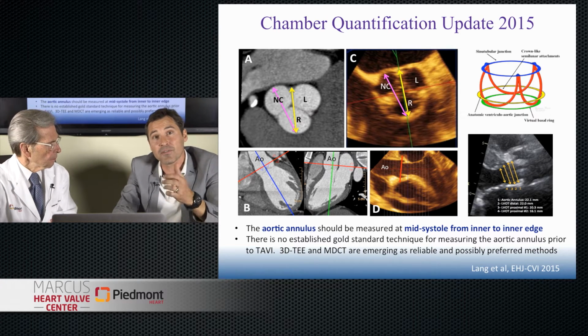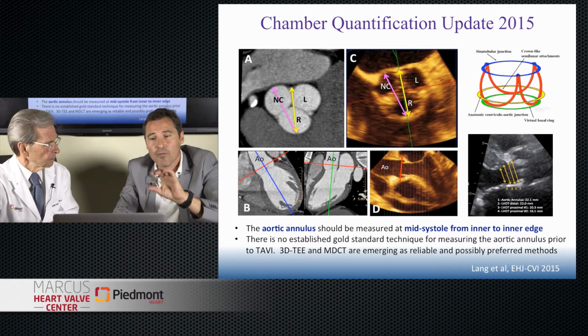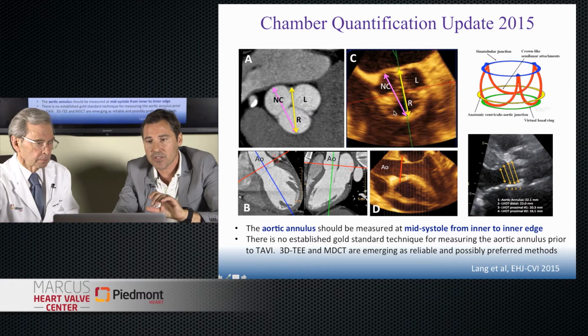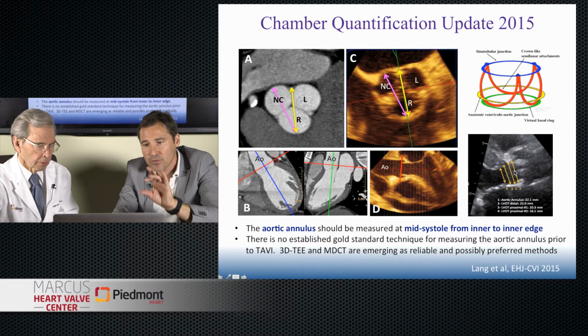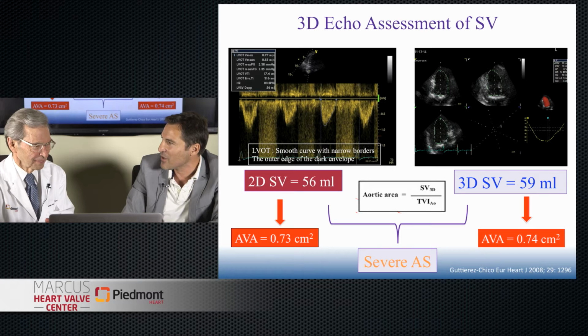And the advantage of CT or even 3D echo is that we can measure the sagittal diameter, which is common in the parasternal long axis view, and the coronal. We can measure this and see exactly the minor and the largest diameter. So maybe if you want to avoid measuring the LVOT, just take the 3D echo imaging and you can measure the stroke volume.